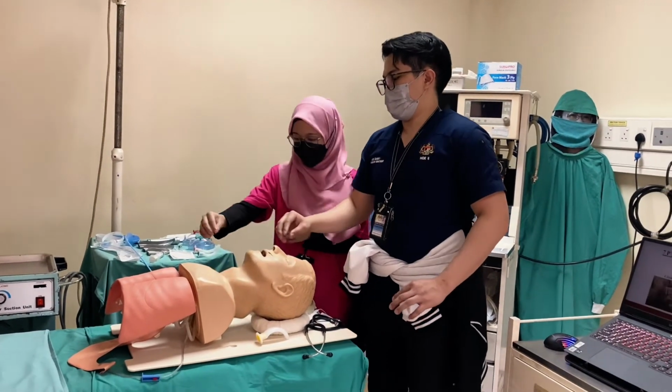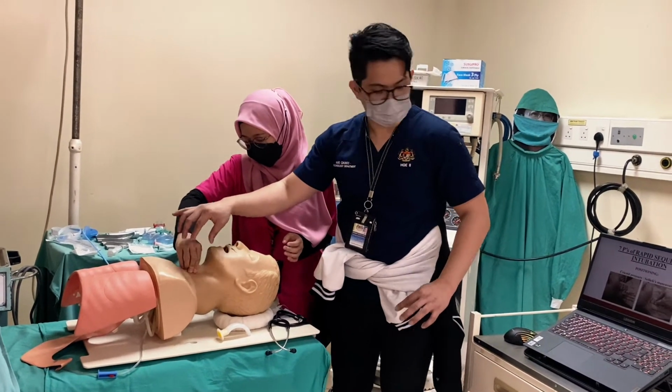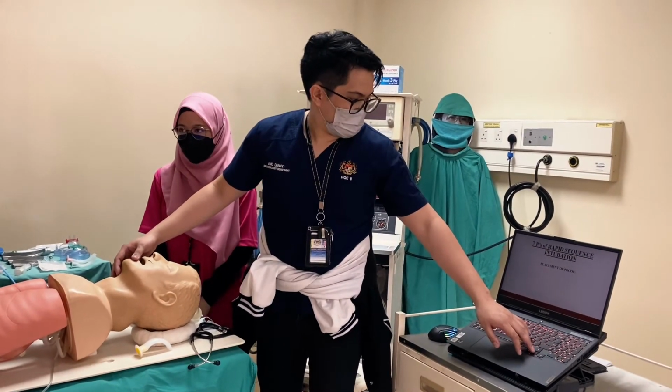Compress, giving a pressure. Okay. No need to go hard, just relax. Okay. This is one of the examples. Relax, just relax. Now, the placement of proof.